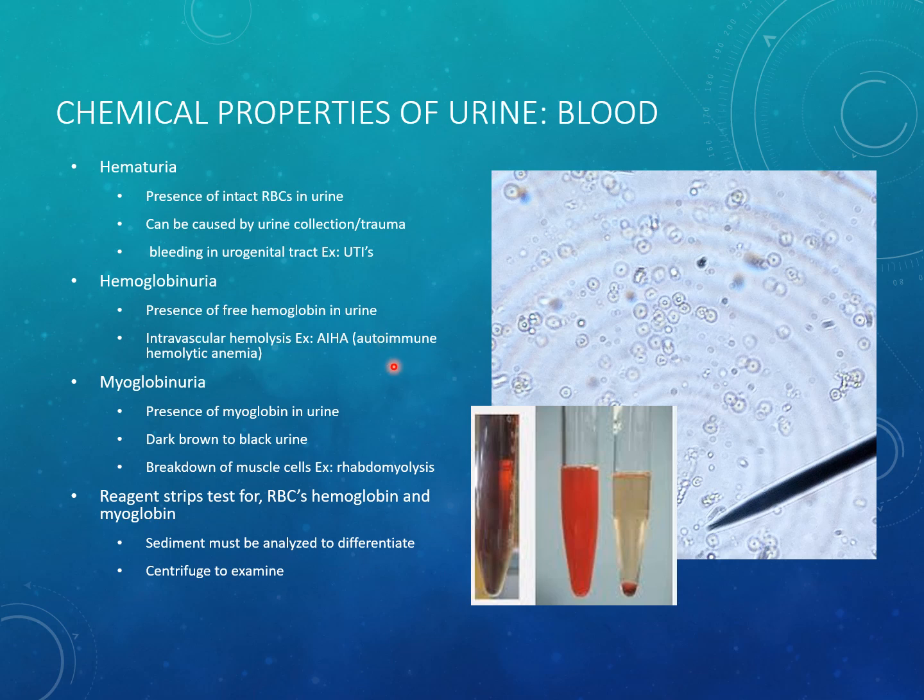Hemoglobinuria is when we have specifically hemoglobin in the urine. And in this case, when you spin it down, because the pigment is already outside of lysed or broken cells, the urine is still going to appear red after being centrifuged. When there's hemoglobin in the urine, it's usually due to some kind of intravascular hemolysis, meaning that the red blood cells are being broken down in the veins way before they get to the urine.